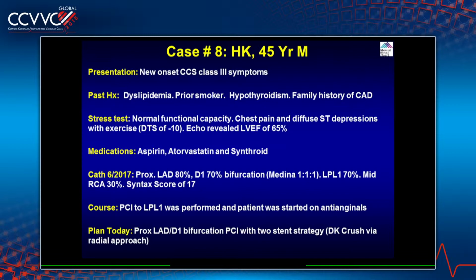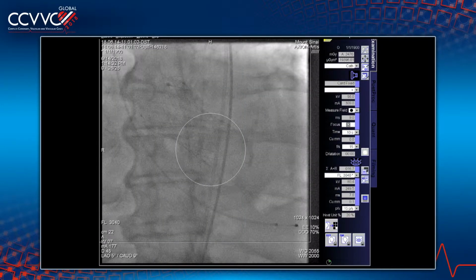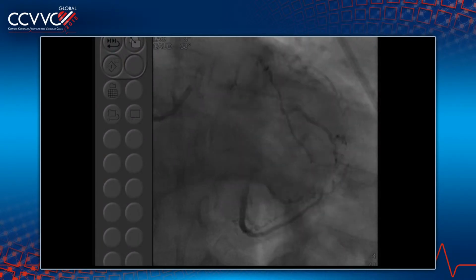Okay, show us the significance. EF is normal. No, we can't see anything. We are seeing your face. Show us the angiogram, please. So he had a 90-95% lesion. No, we're still seeing the TAVR. TAVR looks good. Thank you. Oh, here we go.